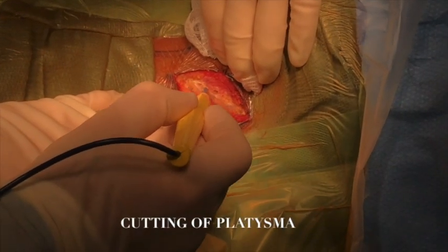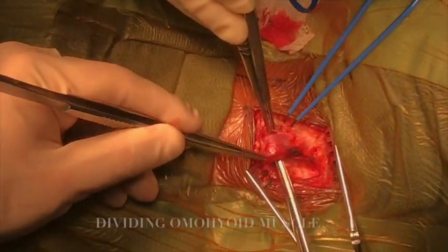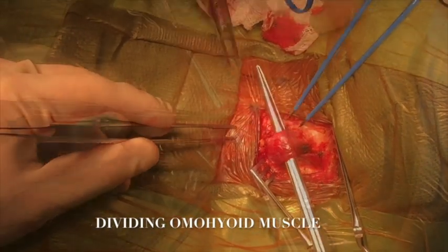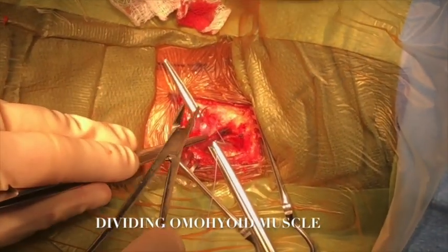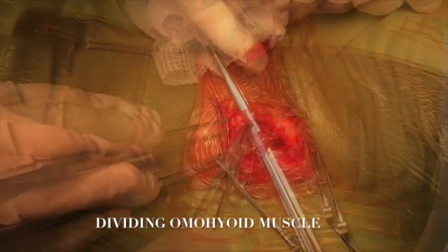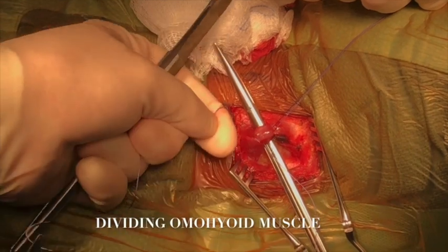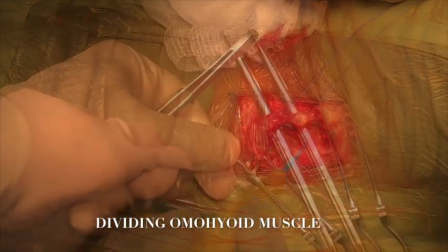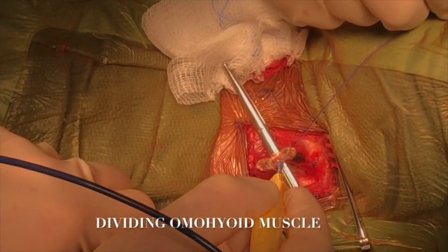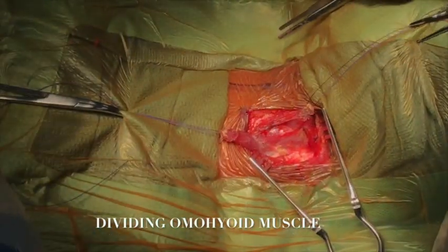After skin incision, we incised the platysma muscle. We identified the left-sided omohyoid muscle and dissected it. Stitches were placed proximally and distally, then we incised the muscle and divided it with bipolar cautery. The edges of the muscle were retracted superiorly and inferiorly, serving as a form of retraction.